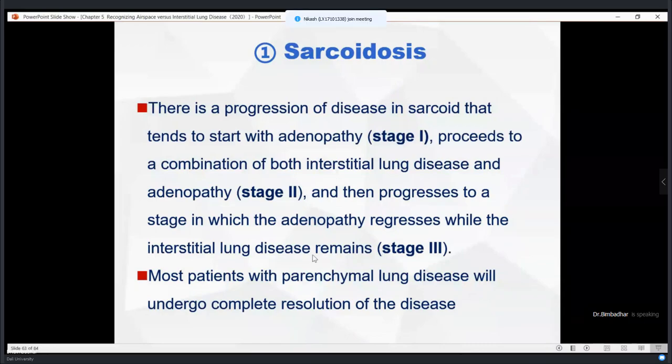So how can I understand this? If I have different X-rays of a patient in stage 1, stage 2, and stage 3, how can I differentiate these three people? Or even if the X-rays belong to the same person, how can I find out whether the patient has been remitting or progressing?